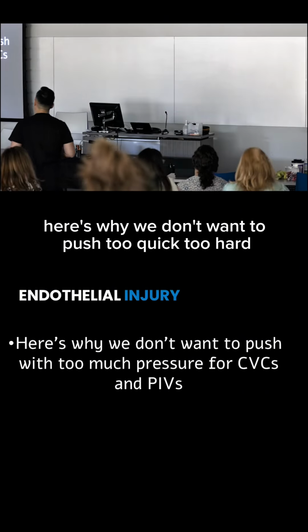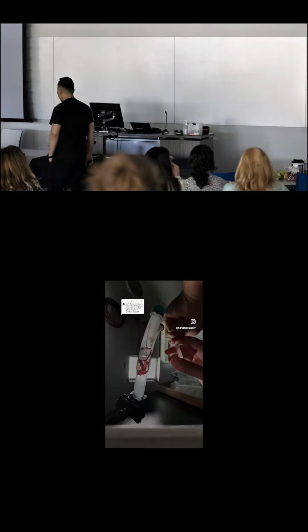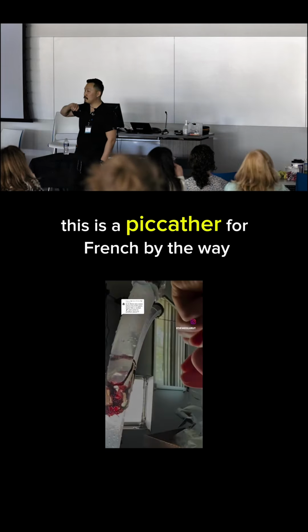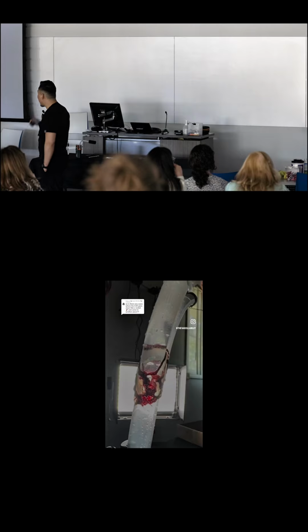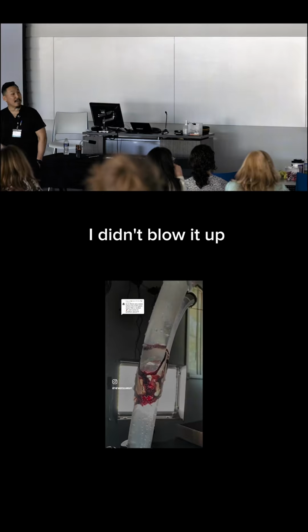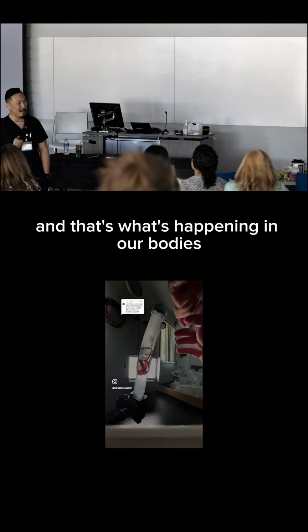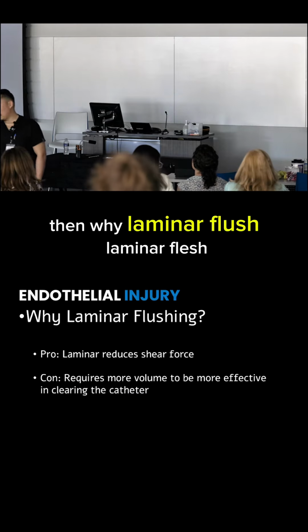Okay, so here's why we don't want to push too hard. This is a PICC catheter, 4 French, by the way. Okay, so I didn't blow it up, but I did move it significantly, and that's what's happening in our bodies. So then why laminar flush?